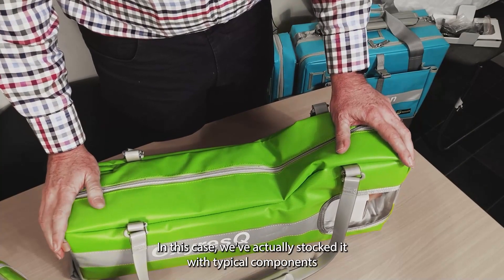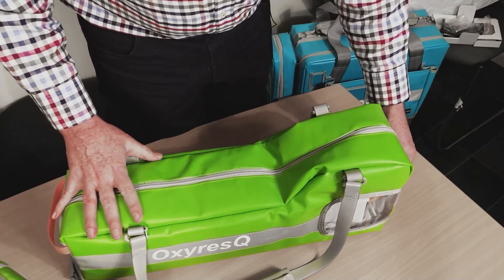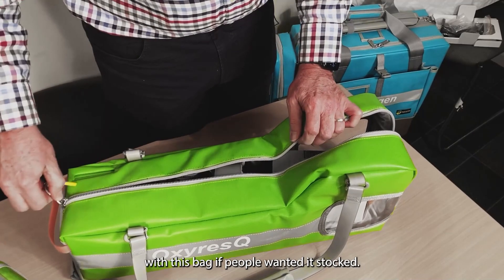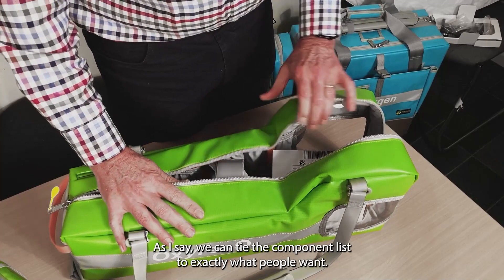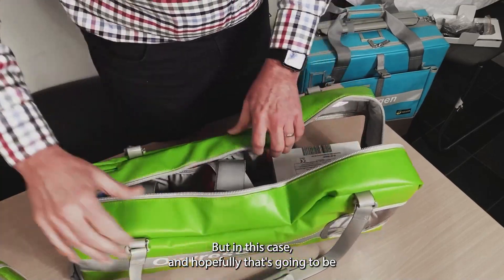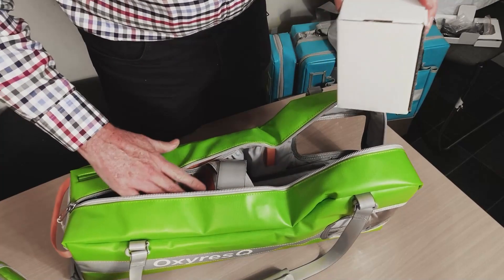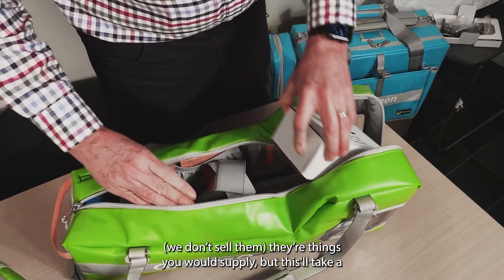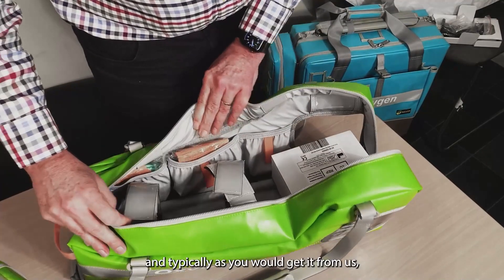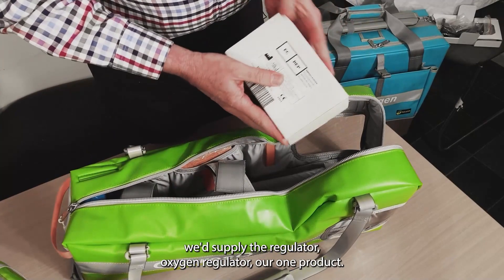In this case, we've stocked it with typical components that we would supply with this bag — though we can really tailor that to exactly what people want. You'd obviously have your oxygen cylinder; this will take a C-sized cylinder. Typically, as you'd get it from us, we'd supply the oxygen regulator.